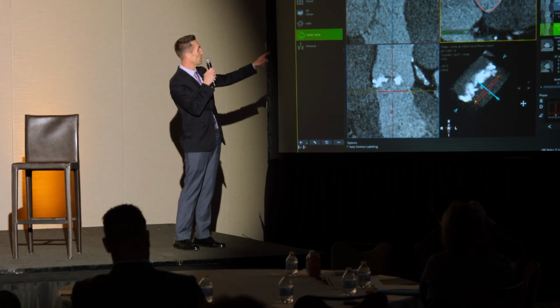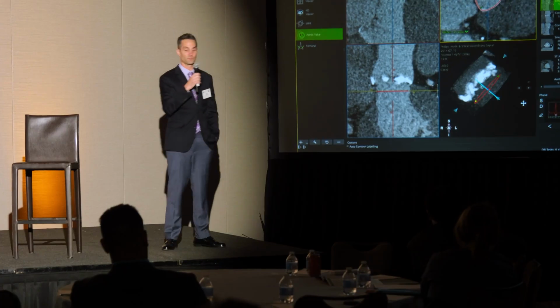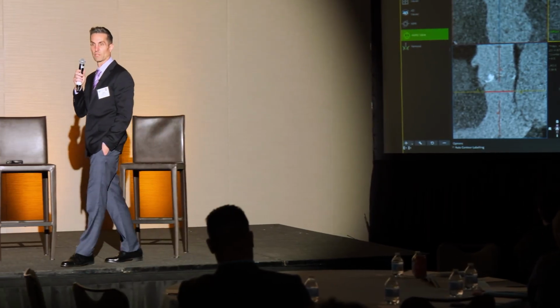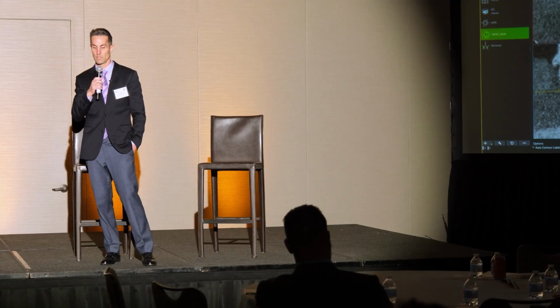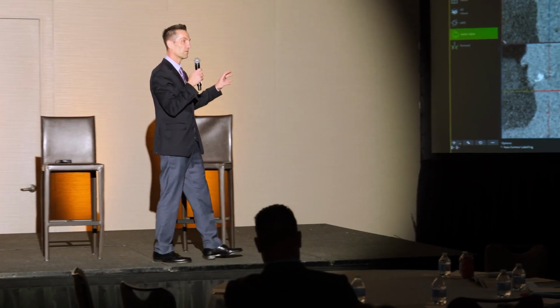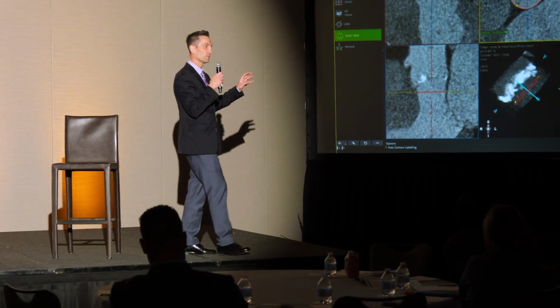So you see how often, and this is a lot of times contrasted with echocardiography, which in the LV outflow tract, and that's why the CT becomes more accurate with its measurements, is echocardiography puts some assumptions in for its quantification because of the differences in the imaging technique.